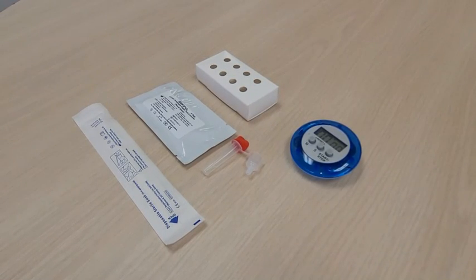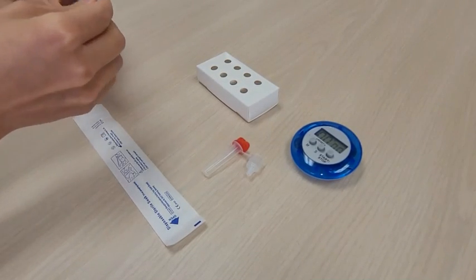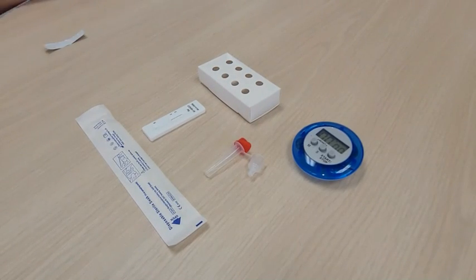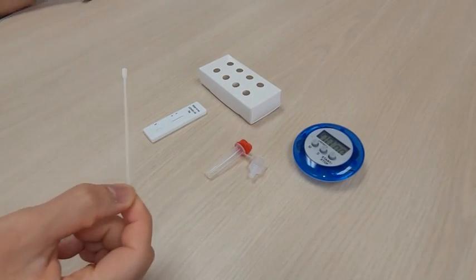When ready, remove the test cassette from the sealed foil pouch and use it within one hour. Ensure it is placed on a clean level surface. Collect the nasal pharyngeal swab sample as per standard specimen collection guidelines.